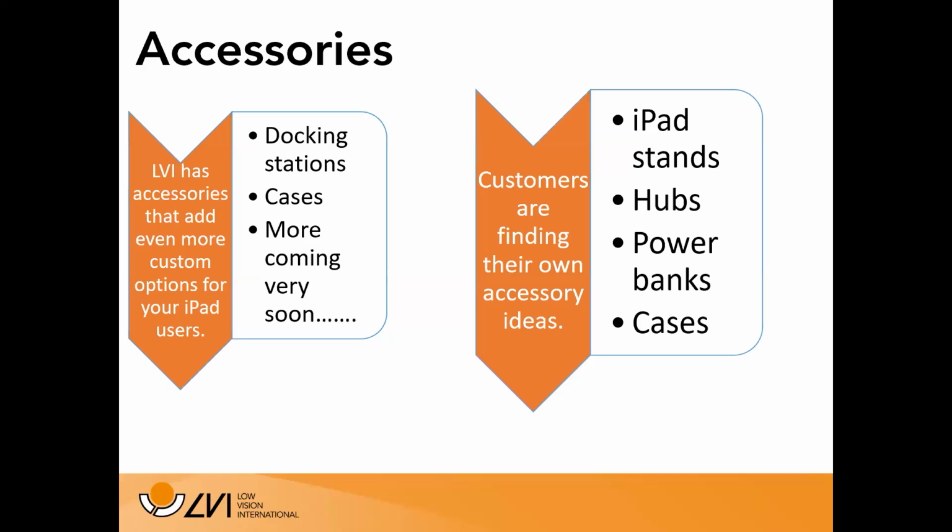And then a final accessory to think about would be cases. Again, with iPads, there are 800,000 million zillion cases out there, some of them with keyboards, some of them with kickstands, some of them protective for those individuals and students who may be a little rougher on their technology than others. So these are just some ideas to think about when it comes to coming up with a customizable solution with one of our cameras, your iPad, and our Magnilink Viewer app.